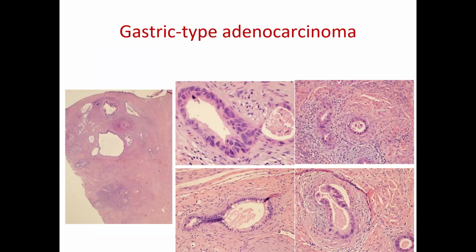This is another case that is also mucin producing. It's a mucinous carcinoma. Nobody disagrees with that. Yeah, it's mucinous carcinoma, but it is different. Why is it different? Well, for one thing, look how aggressive it is. So these tumors, typically, by the time we diagnose them, they are already very deeply invading into the cervix. What is so different about this case? I don't know what's different.